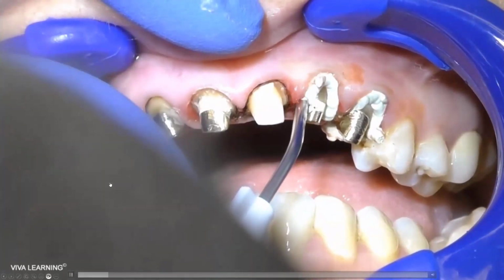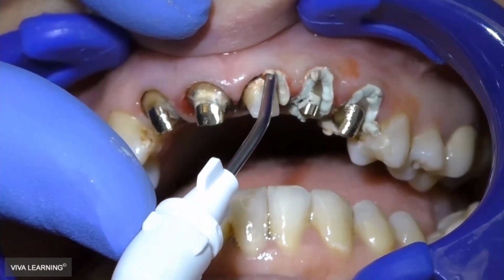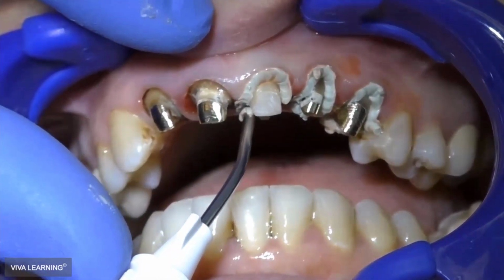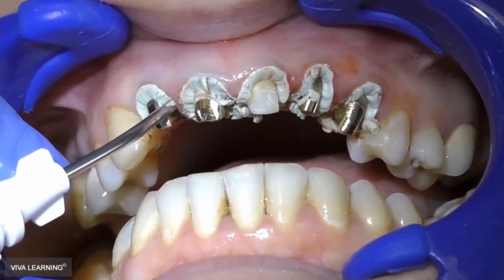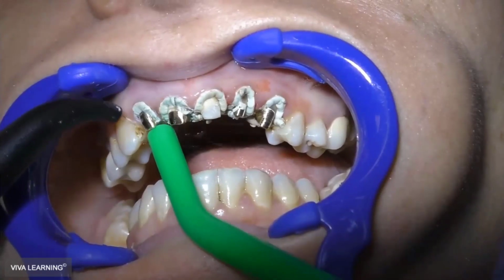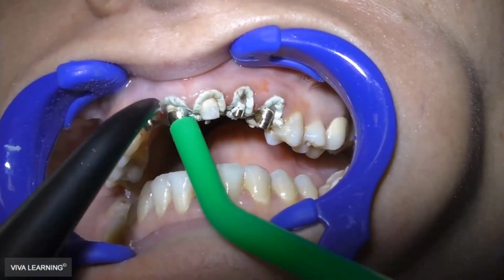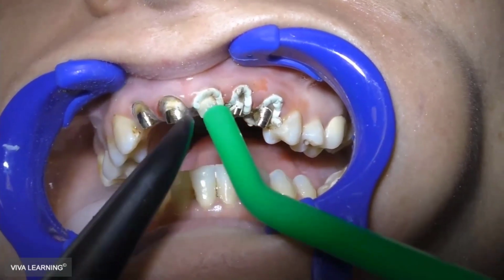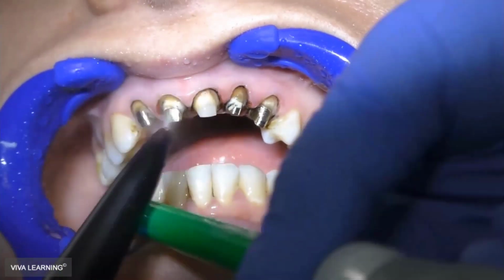So you place the material in the sulcus. This is a modified double cord technique. You can see the retraction cord already placed in there. Take a closer look at the gingiva. When I'm applying the material, you can see the gingiva instantly getting white because of the astringent inside. You leave it in place for 2-3 minutes, and then you wash it with a lot of pressure. Don't be afraid, you'll not have secondary bleeding.